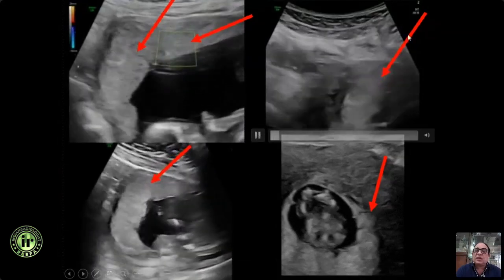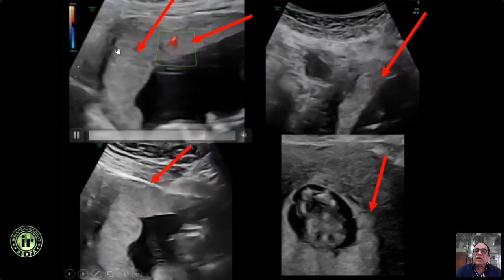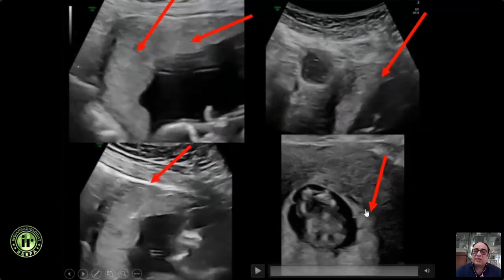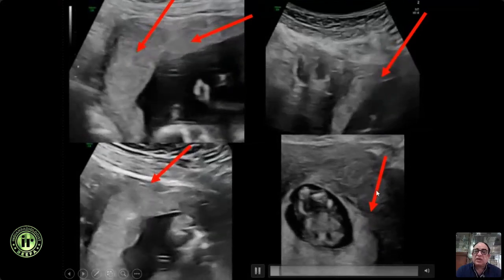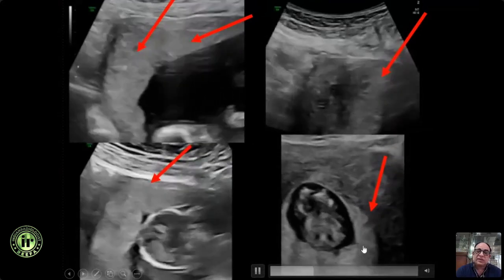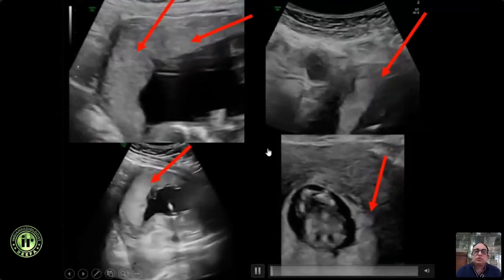Now, this is another one which is slightly more difficult. It's a thin placenta, not as good as this one, and you can see the needle going in. This is a low-lying posterior placenta here, and you pass the needle from front and access whatever site is accessible. That is the best place to get some tissue.